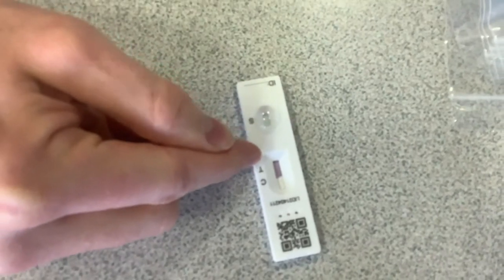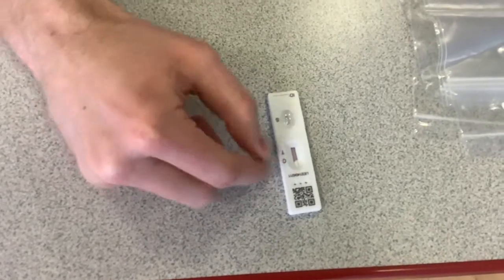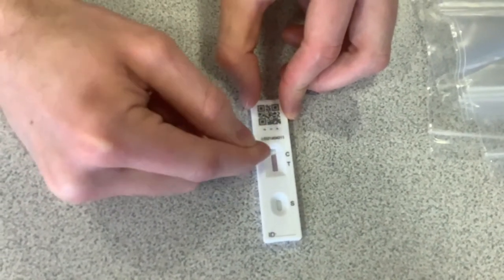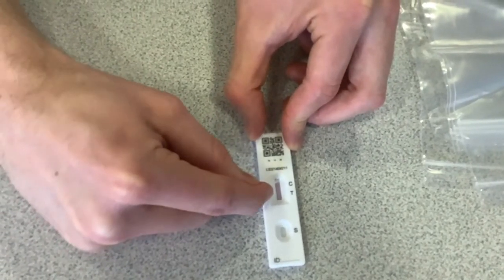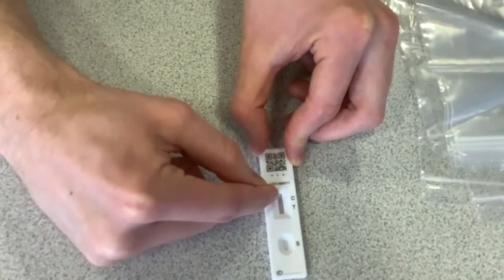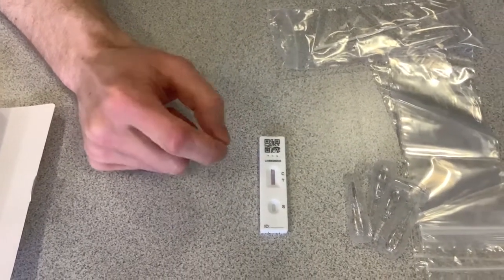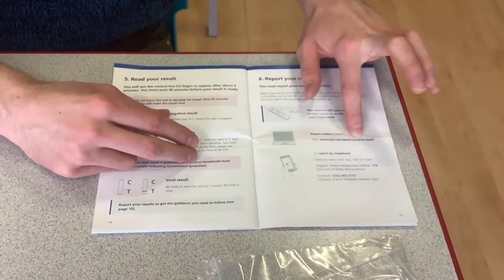Once you have waited 30 minutes you'll come back to your test and interpret your result. The dark purple fluid will fade as the test develops. In the results panel there is a C and a T — if the test is negative there will be a red line on the C, which stands for control. If the test is positive there will be a red line on both the C and the T, which stands for test. If there's a line only on the T, or no red lines at all, the test is void and you'll have to take another one. Please note: even though a line on the C may develop quickly, you must wait the full 30 minutes before recording a negative result. Once developed, follow the steps on page 15 to record your result.